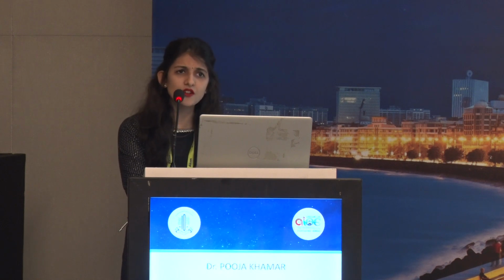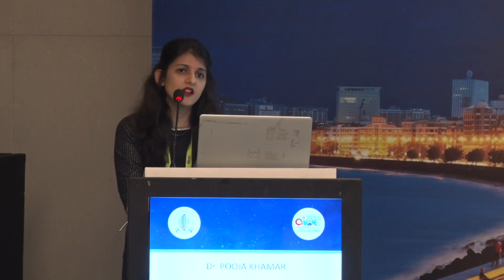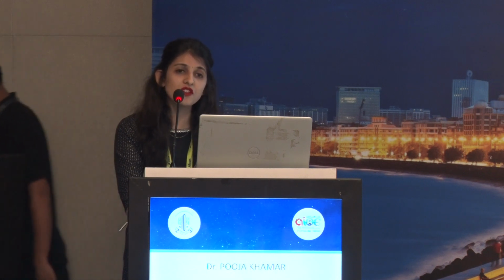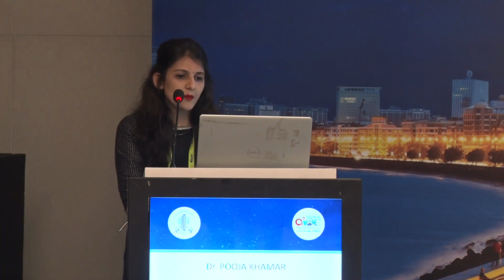Now your normal calculator is not going to let you use a 65 keratometry reading. There's only one calculator which will probably allow you to do that, and that is the Kane calculator. Now the Kane formula was introduced in the year 2017. It's a relatively new formula, and it lets you use the keratometry readings up to 65. So we went ahead, planned a toric for this patient, and she had a good outcome as well.